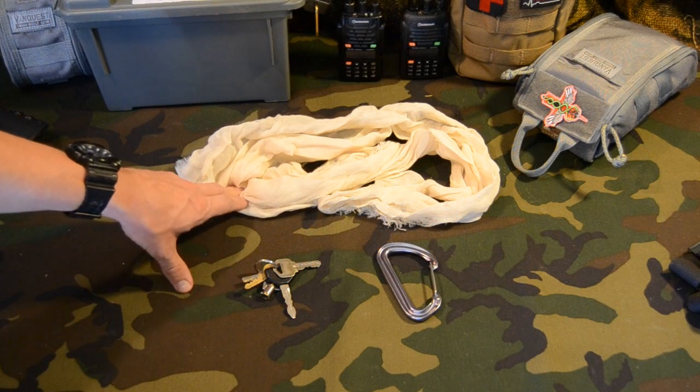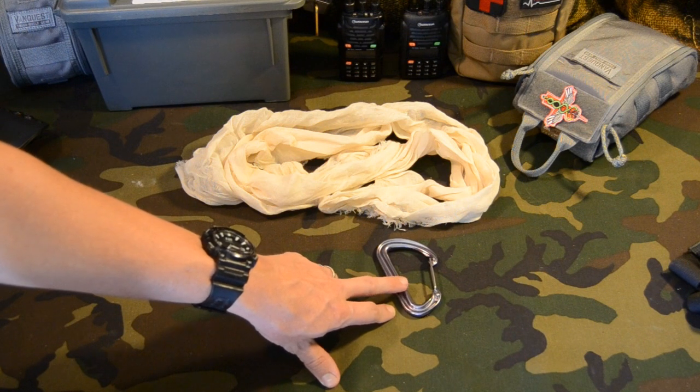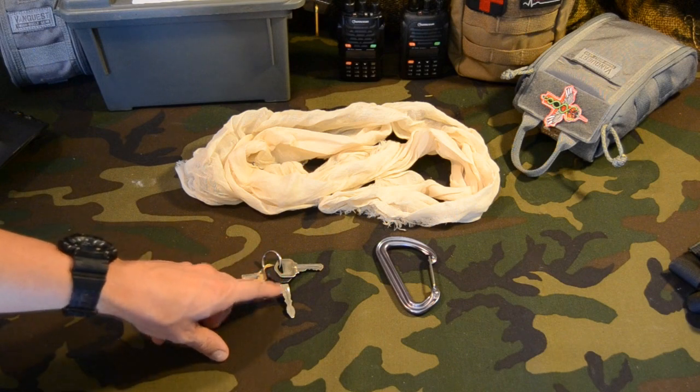Basically we are going to use the triangle bandage as the actual tourniquet, the carabiner as a windlass to tighten it up and cut off blood flow, and then we are going to use the key loop here to lock it in place.